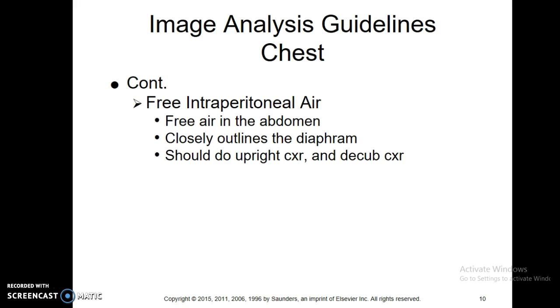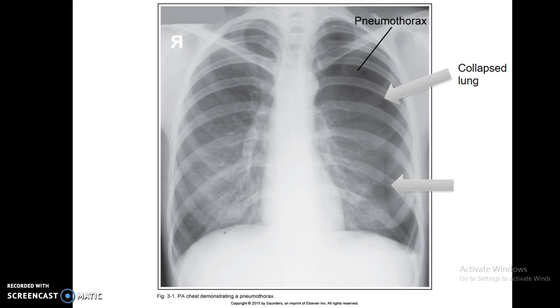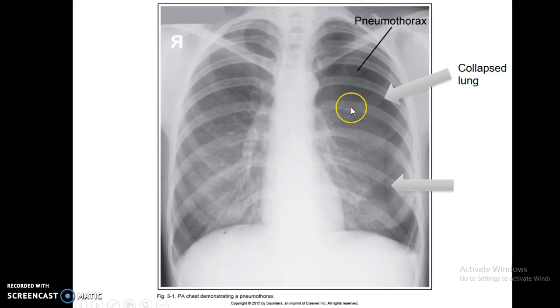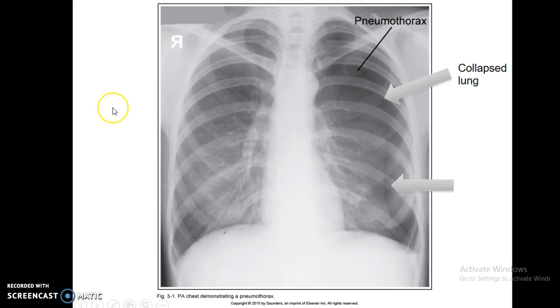Free air — we'll talk about that more in the abdomen. On this image, pneumothorax is going to be on this side of the lung. You are going to see the lung markings just disappear from the outside portion. Looking towards the lateral portion of the lung, you do not see any lung markings going across feeding that part of the lung because it has been deflated — it's going to look like a balloon slowly losing its air. Sometimes it can be small like this; sometimes it can be a complete collapse with no lung markings at all. It's important to make sure the medial border of the scapulas are pulled forward so primary care doctors don't see a scapular line and mistake it for a pneumothorax.